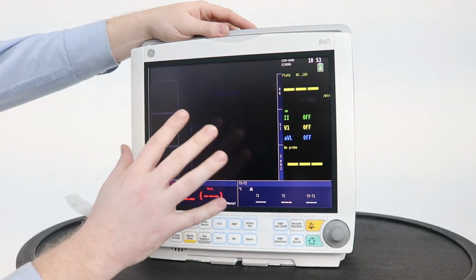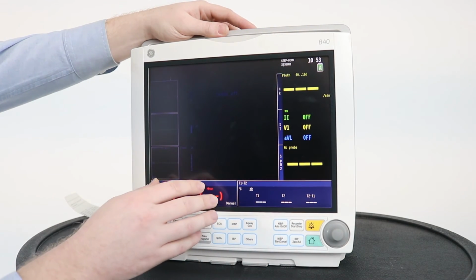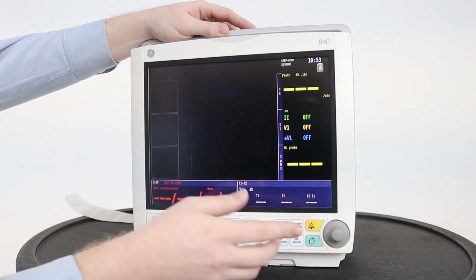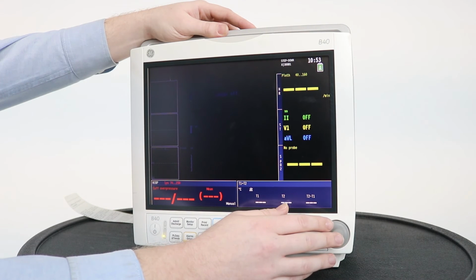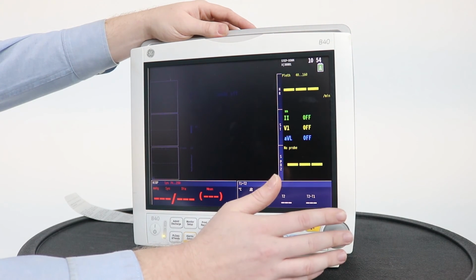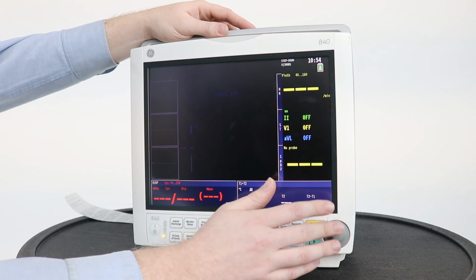changed. If for whatever reason nothing has saved here, go through what we did again and make sure to go part by part, making sure that you're depressing where you want to save things and where you don't. And if after that, and you're 100% sure that you've pressed everything that you want to press and it's still not saving, I would recommend that you get a biomed technician and let them know about this problem, because most likely you're going to need some parts for your machine.